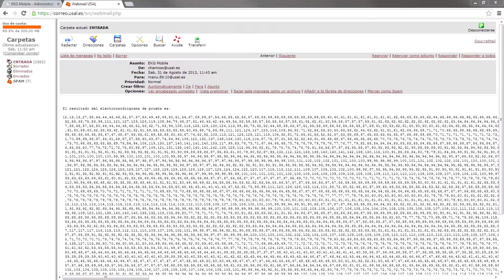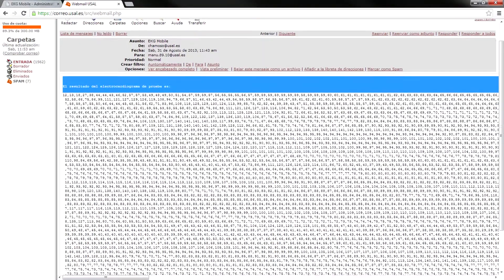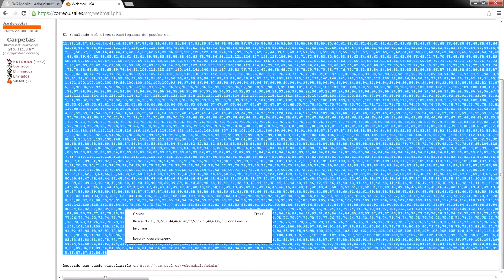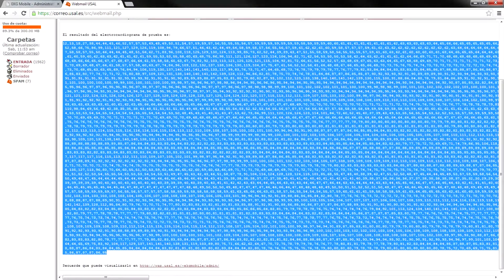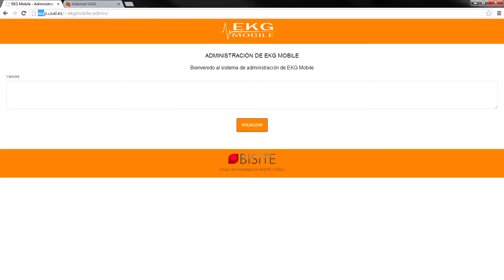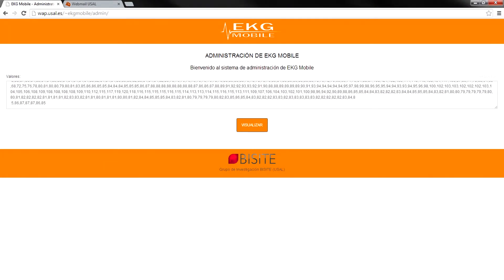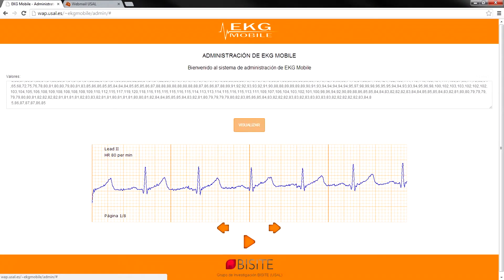Once the results have been sent, the doctor will receive the email and paste them in the administration tool as shown here. Enter the values and click on the View button. The system displays the patient's electrocardiogram.